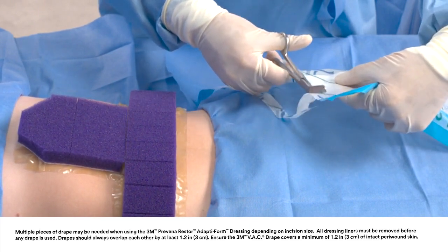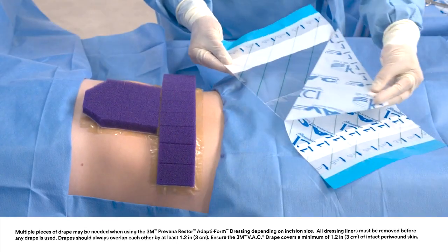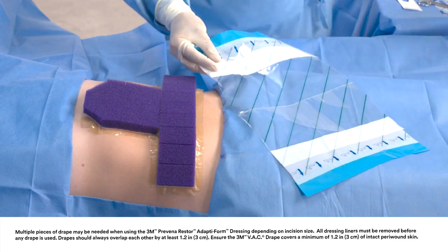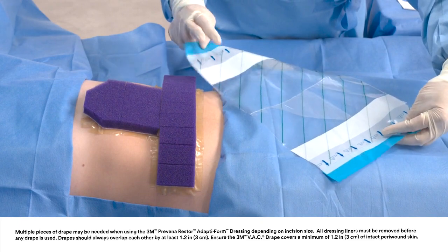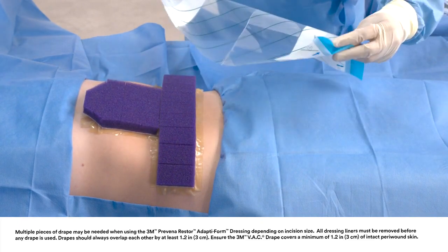There is no drape under the blue handling bars. Carefully remove the middle section of layer 1 from the drape to expose the adhesive. Leave the two end sections of layer 1 intact to maintain drape stability during application. The drape should be held by the blue handling bars.